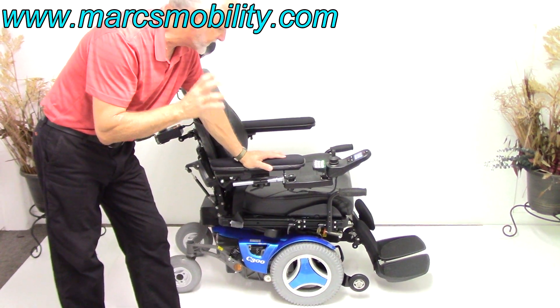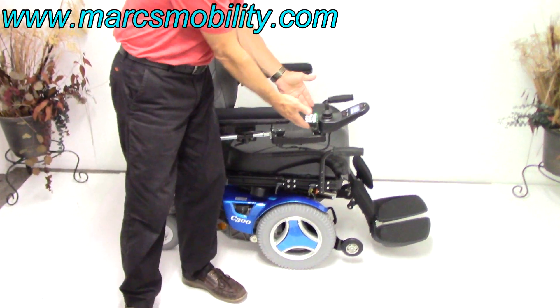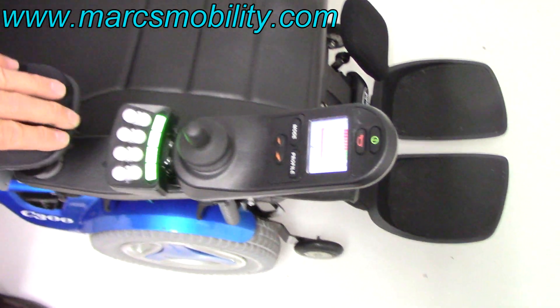All the functions — the seat lift, the tilt, the recline, the legs — all of them can be worked through the switch box back here or through the joystick. I'm going to do it through the switch box.